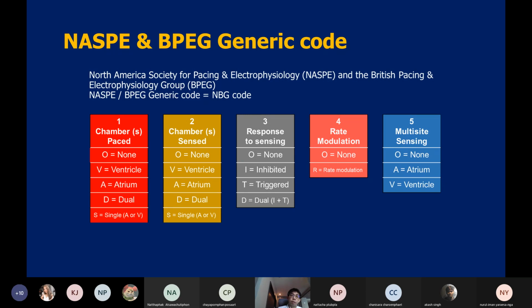I is when the pacemaker senses intrinsic rhythm from the heart, it inhibits itself not to fire the pace out of the machine. For example, if you have a single chamber pacemaker VVI that could pace from V and sense from the ventricle, and if you have intrinsic rhythm from V coming to the leads and the pacemaker could sense that, the pacemaker would inhibit itself not to fire a pacing spike out of the generator.